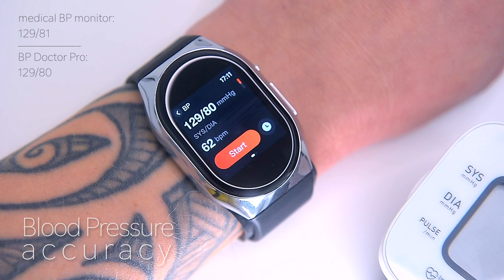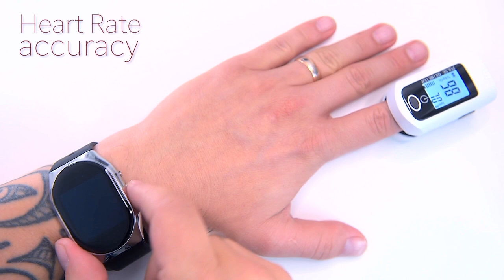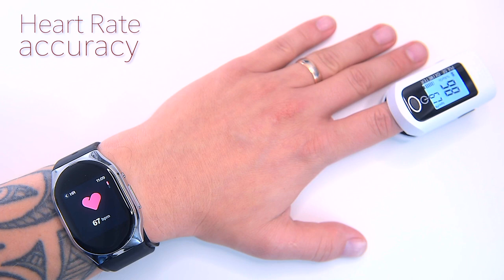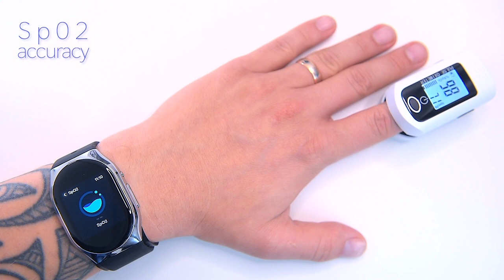In conclusion, the BP Doctor Pro is accurate at measuring blood pressure and it's incredibly convenient and far easier to use than a medical blood pressure monitor. Now let's check heart rate accuracy — I'm going to run the BP Doctor Pro against a finger-clamped medical pulse oximeter. For heart rate measurements the watch doesn't need to pump the cuff; it only uses the PPG sensor. The final readings are 66 BPM on the watch and 66 BPM on the oximeter. Let's also check SpO2, which is blood oxygen saturation level. A normal level is usually 95% or higher, and the readings are identical: 98% on both devices.